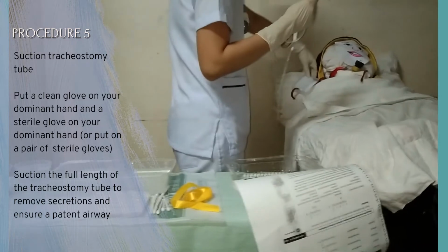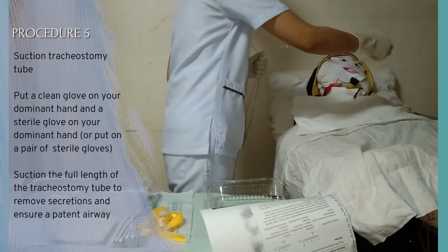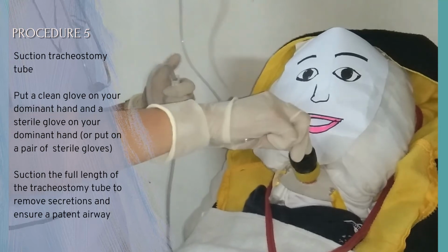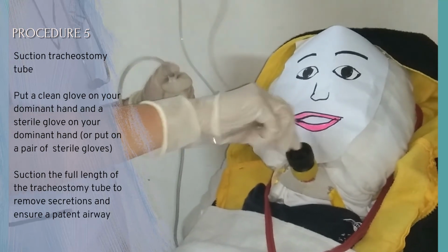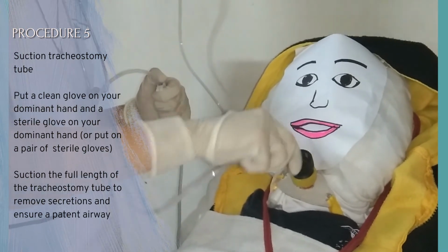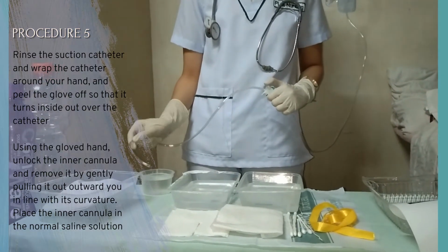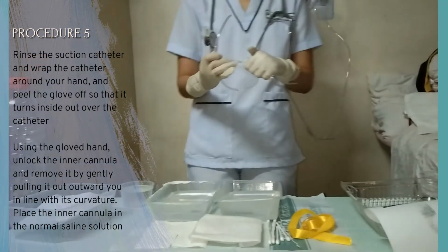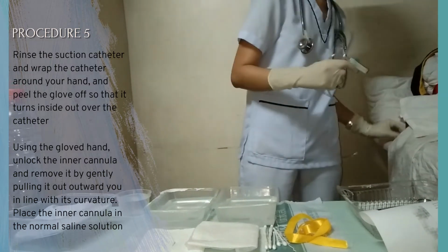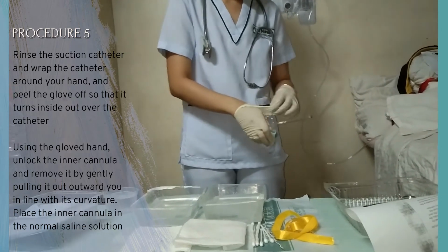Suction the full length of the tracheostomy tube to remove secretions and ensure a patent airway. This is to ensure effective ventilation for the client. Rinse the suction catheter and wrap the catheter around your hand and peel the glove so that it turns inside out over the catheter. This clears the catheter of secretions and avoids introducing pathogens into the airway. Wrapping the catheter in the glove prevents secretions from being spilled from the catheter.